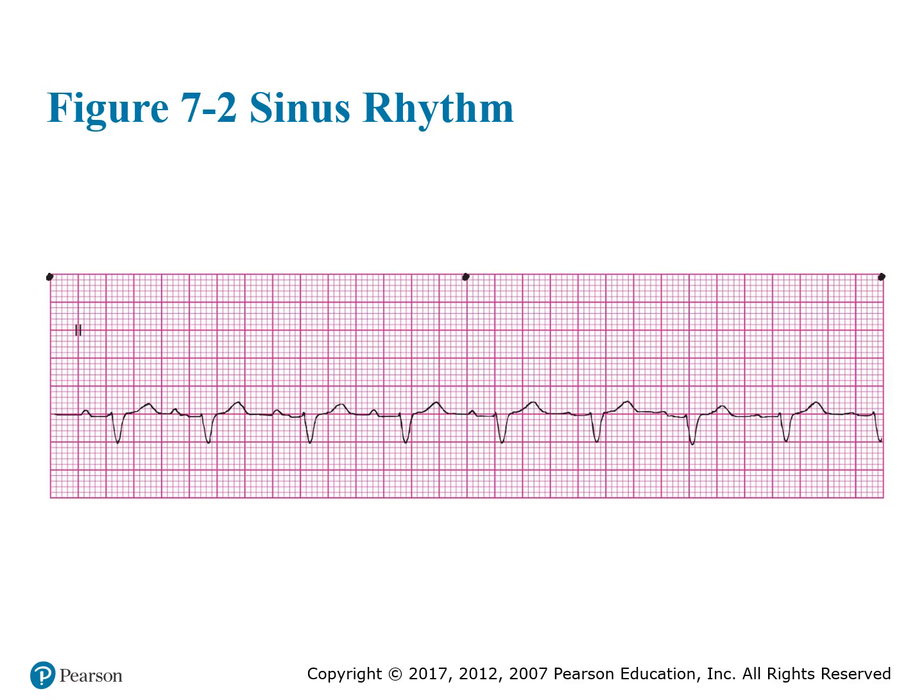Here's where your measurements come in. If you look at it really, really close, we're going to do the P to R intervals. If you measure this out from here to there, this looks like a little bit longer. I'm going to say that's right at about a 0.2, maybe a little bit more. So this is one of the ones that you definitely want to measure out, because if it is greater than 0.2, that is a significant finding, and that's going to put it into a different category. So make sure you measure that out.